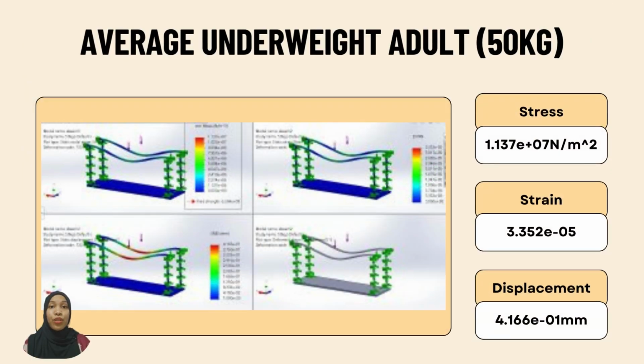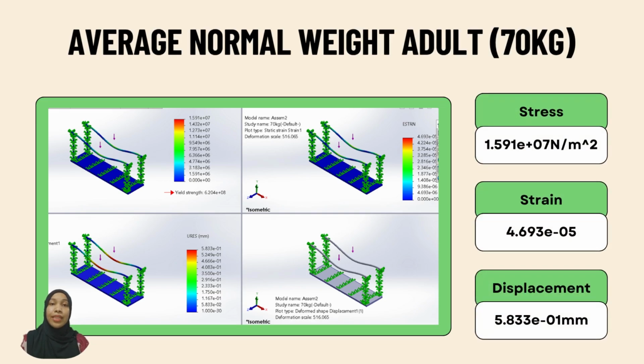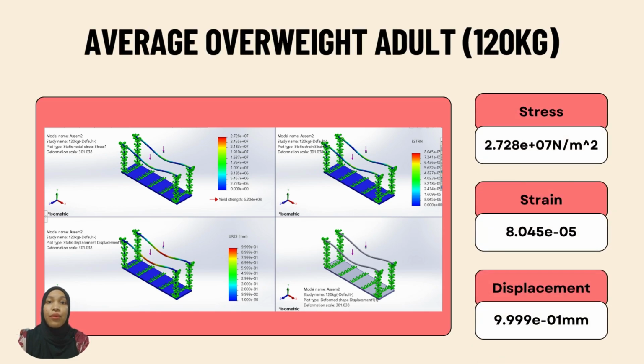The slide shows the simulation result for an underweight user around 50 kilograms. The stress, strain, and displacement are all relatively low, indicating that the design handles lighter users safely. For a normal weight adult, the structure shows slightly higher stress and displacement value, but still within the safe limits. This confirms the design worked effectively for average users. For the heaviest case, the stress and deformation increased significantly. However, the design still holds up, and the displacement remains under 1 mm, which is acceptable for a rehabilitation device.